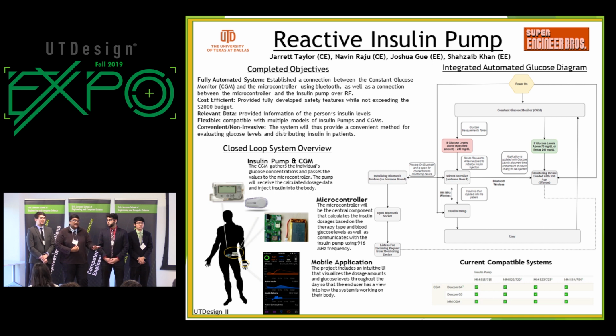And you have to input settings into there for the 2 different algorithms, the bolus and basal. Both of those have a set amount of insulin that you can set into your body in a certain day, and your pump will act based off of that. And if the pump notices that you're not actively inputting insulin based on the regimen that you put into the physical pump, it will start sending you updates there. And we're pulling notifications from the pump as well as from the CGM. So not only will you be getting these notifications on the pump, we'll also be outputting back to your phone. So you're getting the mobile application showing you that, oh, there are these warnings that you're getting from the pump that it's noticing.